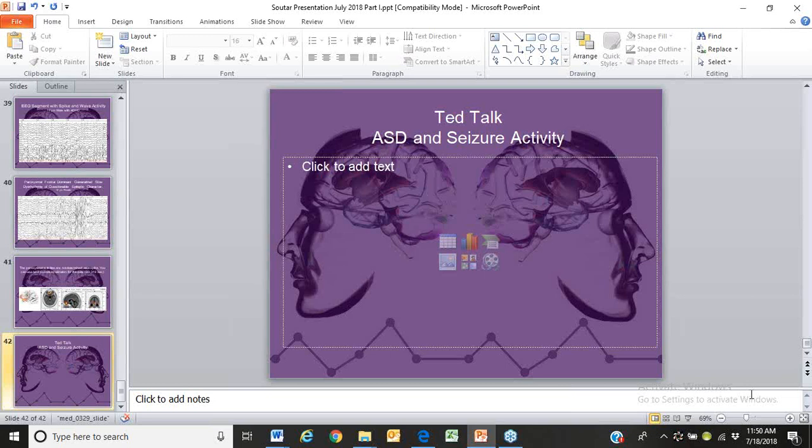Now, if you know that these kids are on stimulants, antidepressants, SSRIs that is, or anticonvulsants, they will make the spikes worse. So we get the difficult cases in our industry, so I think it's something very important to put out to you guys, that you come across, you're doing the EEGs, it's very easy to have them read, and then you can also identify the locations and everything else and start addressing them.